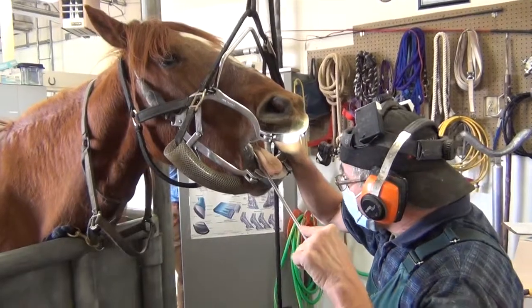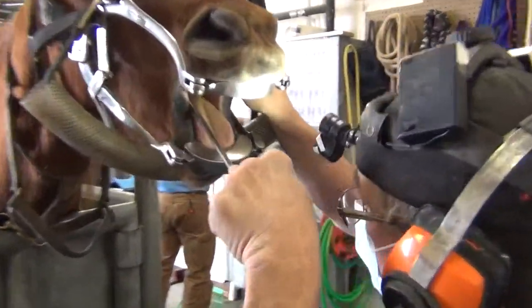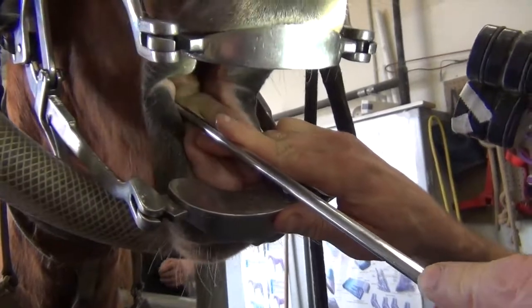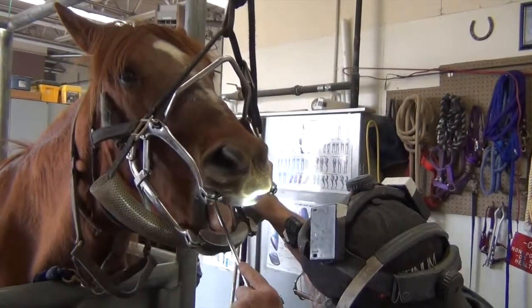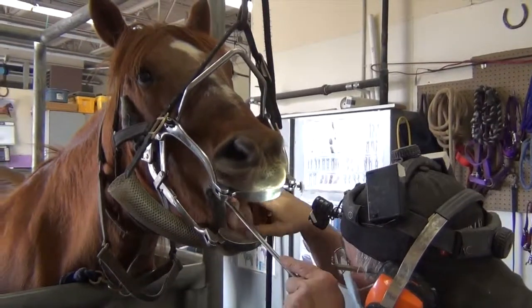With this kind of arrangement we can use this mirror so we can look at the chewing surfaces of the teeth and evaluate them. And she does have some decay, but nothing that is causing any tooth infection. Just some superficial decay on the chewing surfaces of the upper teeth.